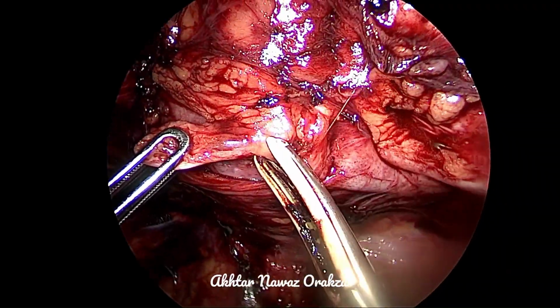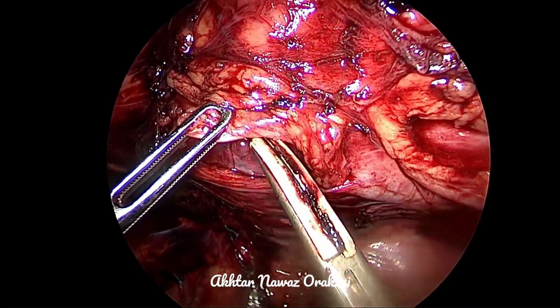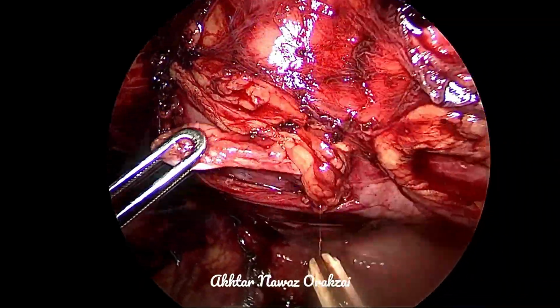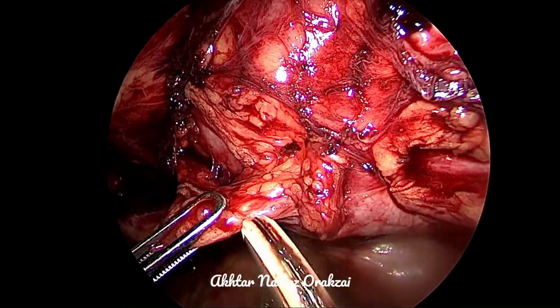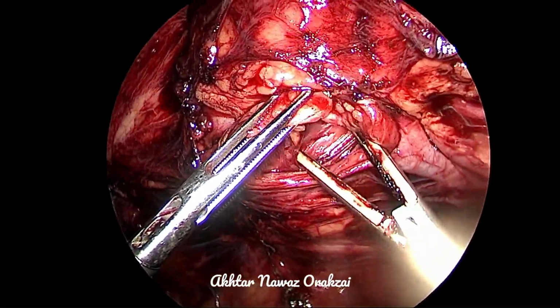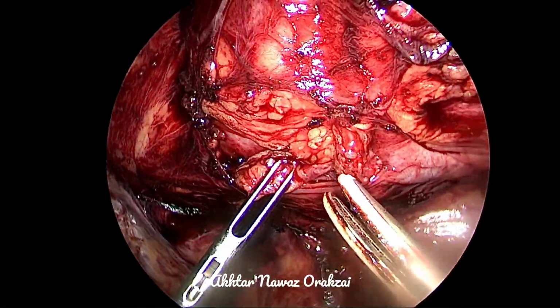And another important thing in the mobilization of the lower polar vessels is that you should not dissect the vessels from the ureter or the PUJ. Rather, you should dissect the PUJ from the vessels in order to avoid injury to the artery, which may compromise the lower portion of the kidney.